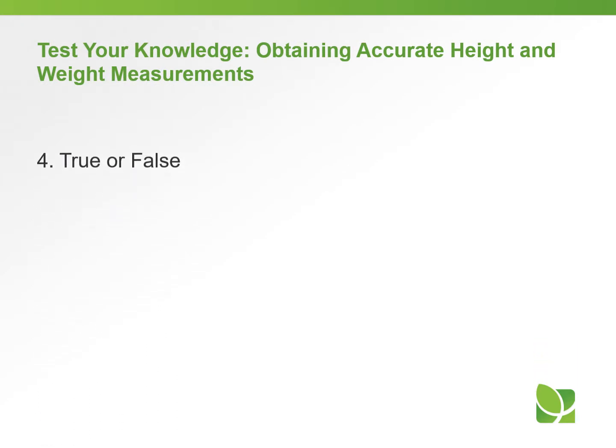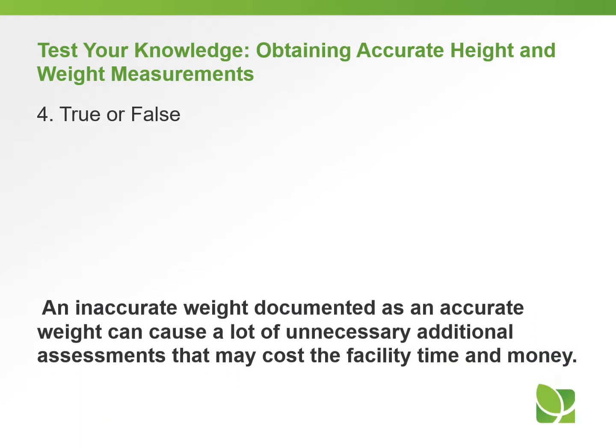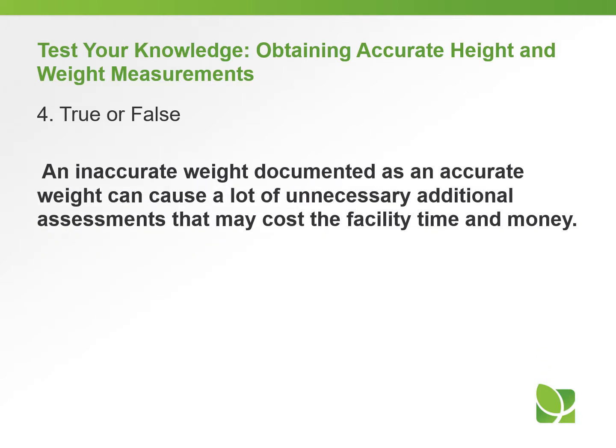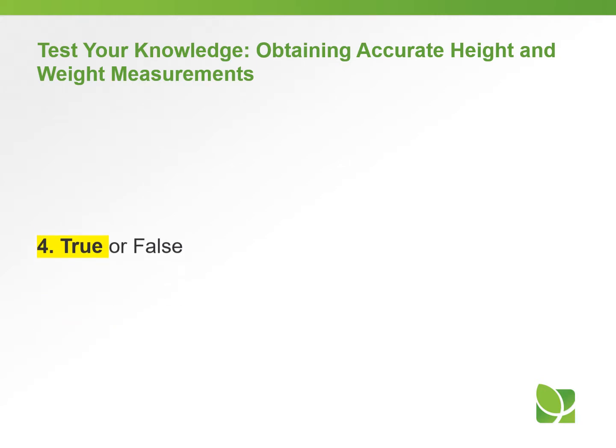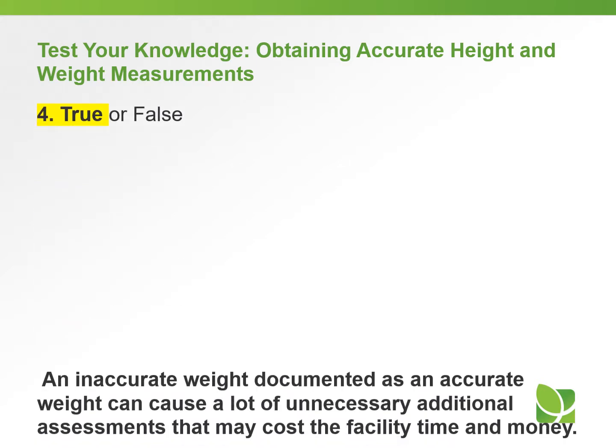Question number 4, true or false? An inaccurate weight documented as an accurate weight can cause a lot of unnecessary additional assessments that may cost the facility time and money. And the answer to question number 4 is true.